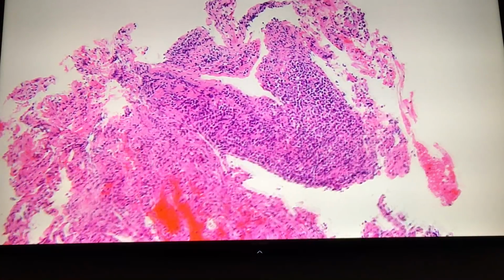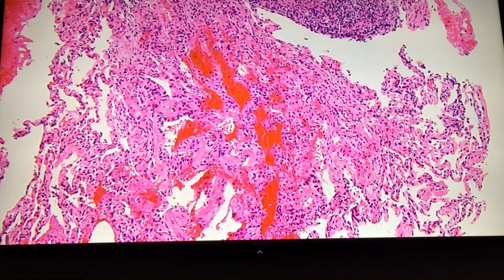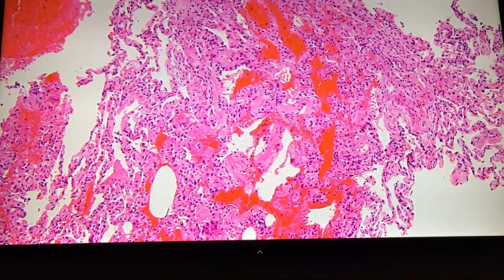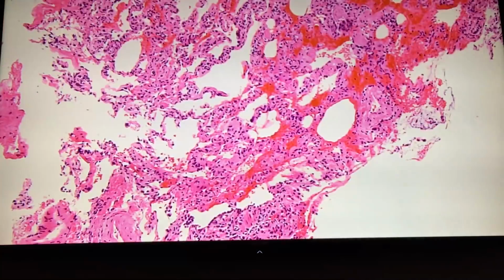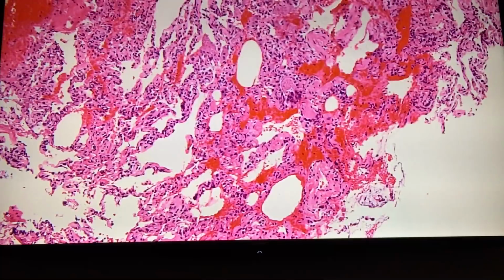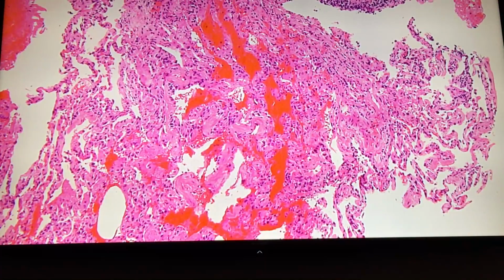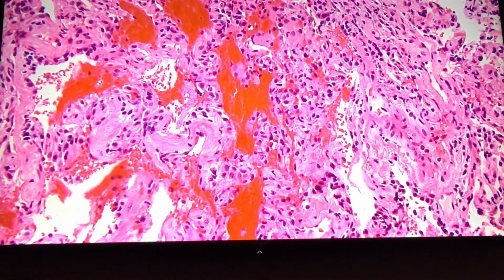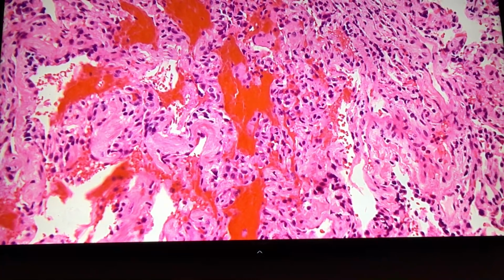Infiltrates, and it's a relatively young person, about my age, with infiltrates. Give them a high mag, Aaron, and just try to get it into focus. Just move it around slightly, little bit.